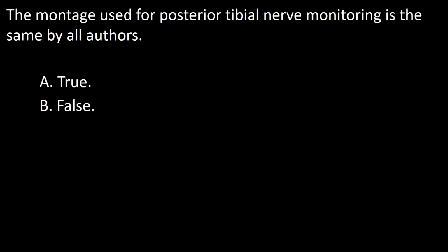Next question. The montage used for posterior tibial nerve monitoring is the same for all authors. A, true; B, false. This panel was used in a prior question to highlight the discrepancy in nomenclature used by different authors. And now I have brought it back to show you the discrepancy of montages used by different authors.